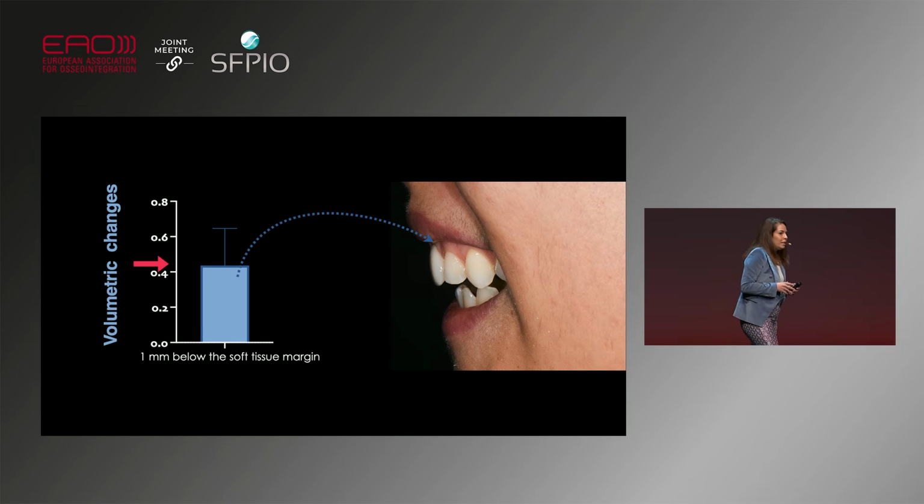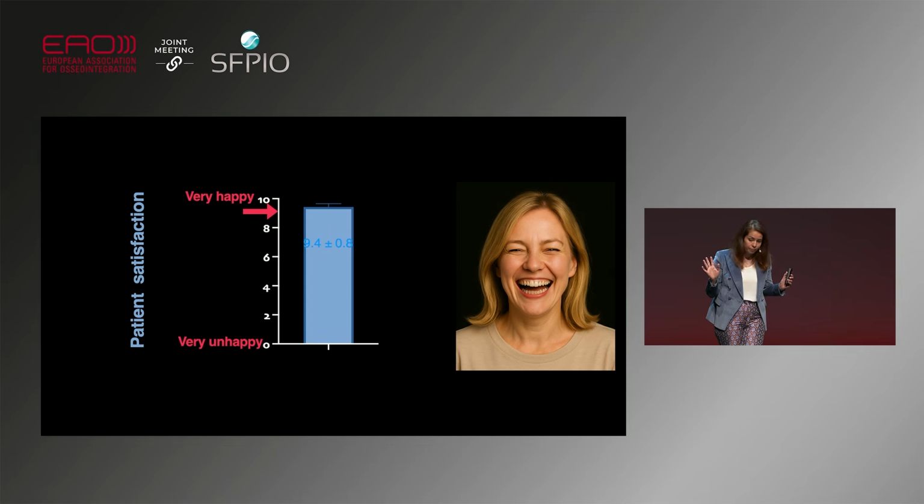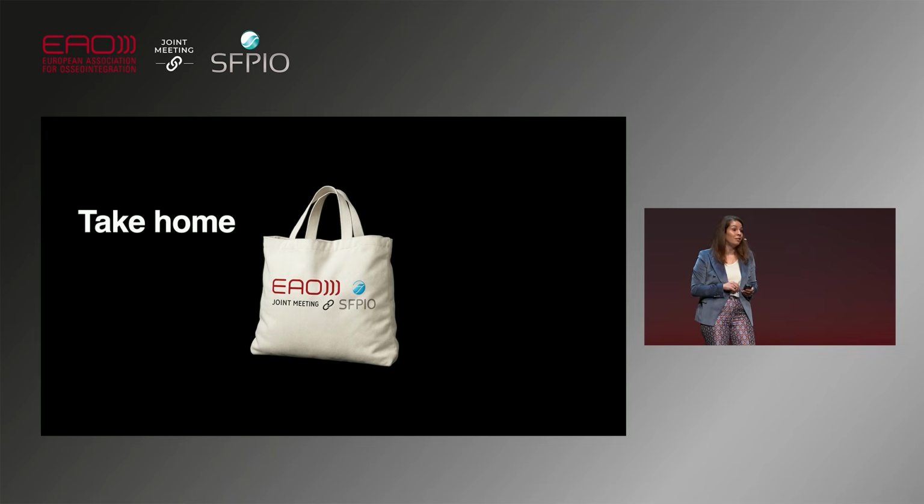0.4, you don't really see, so you can say the buccal contour pretty much remained stable in volume. And we also asked the patients, how happy are you now? Or are you still happy? Yes, they are still very much happy.